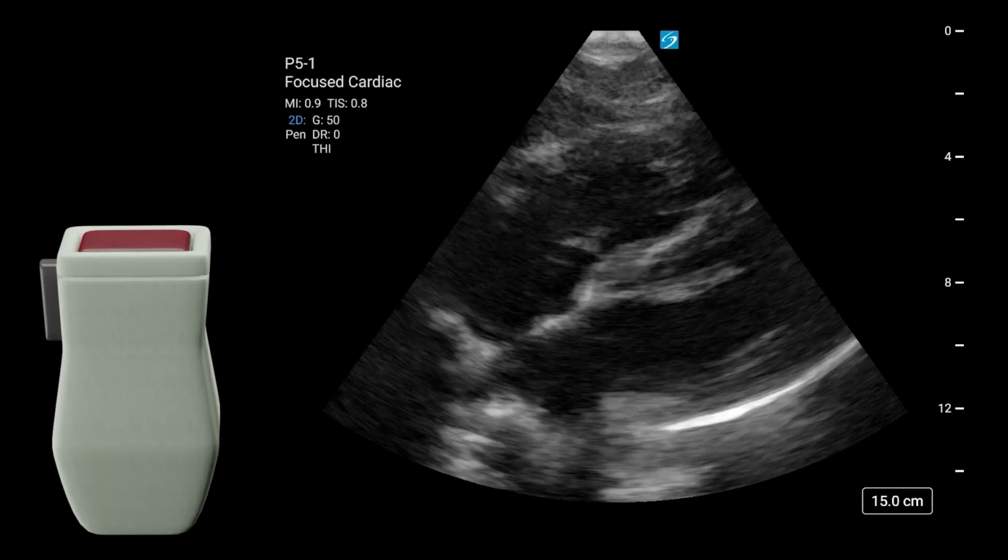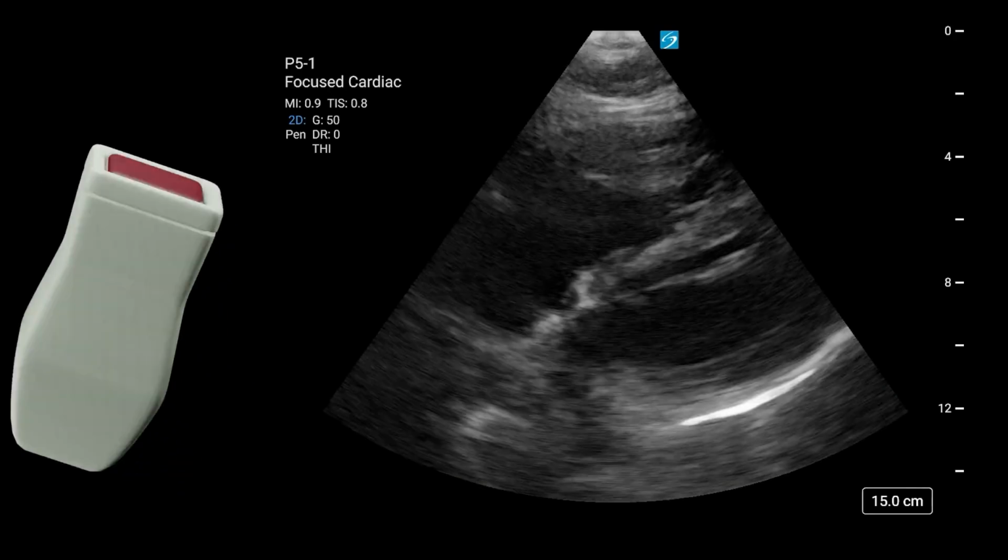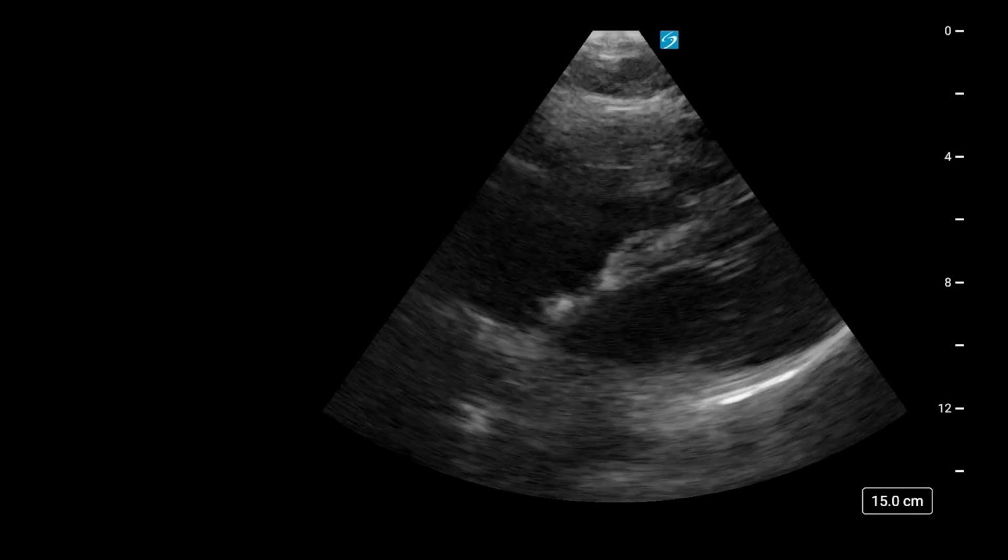The sector looks like a piece of a pie that can be widened or narrowed, again having an effect on your temporal resolution. Interactions with tissue. So far, we have made the assumption that sound waves do not degrade with depth and that all structures are reflective. That is not the case, which is why we need to look at the interactions of ultrasound with tissue.